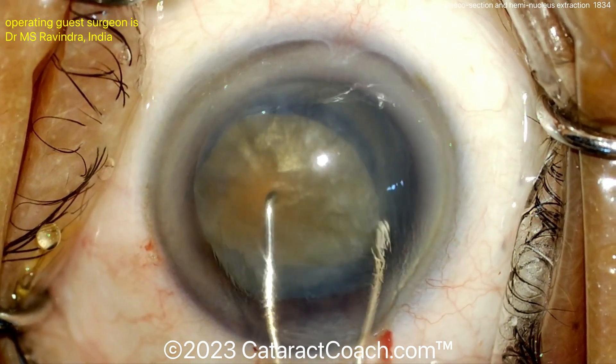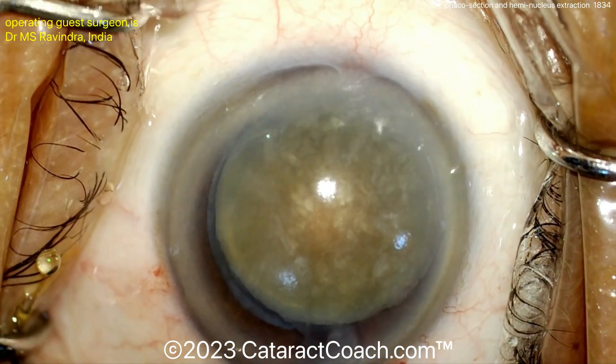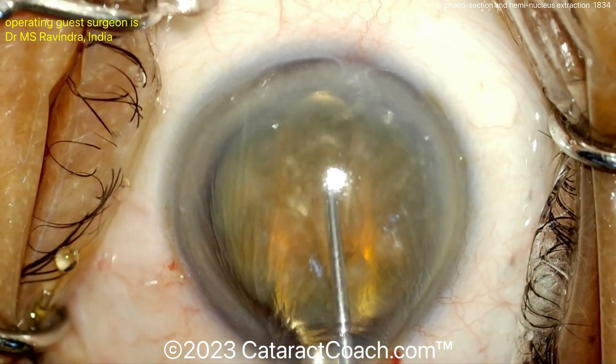Here we go — using a cannula going under that nucleus and just using two instruments to lift that nucleus up out of the capsular bag. I like this dialing technique. There's the entire nucleus in the AC, and then we put some viscoelastic on top of it.